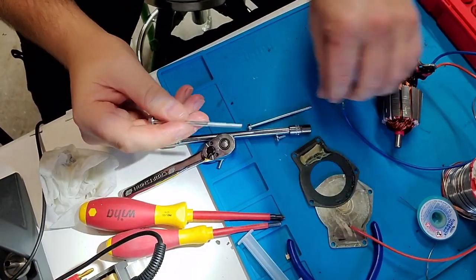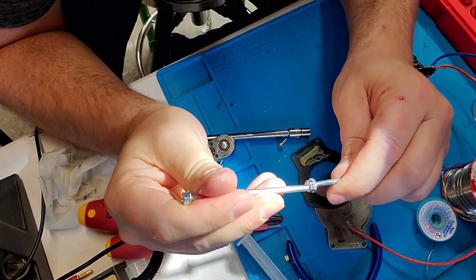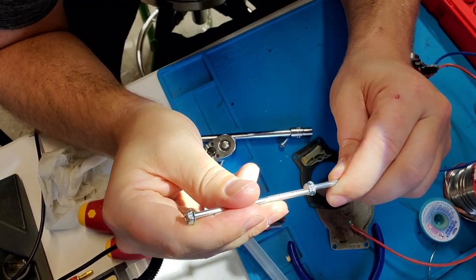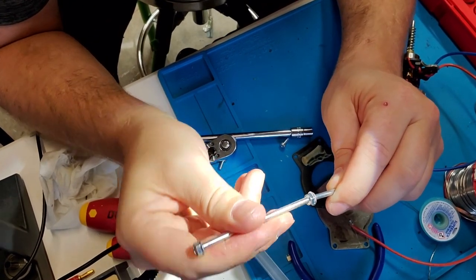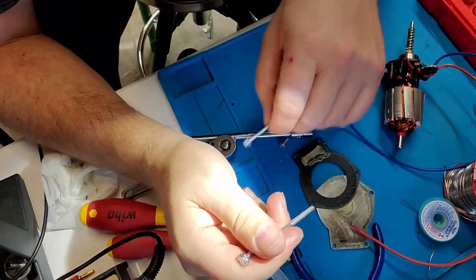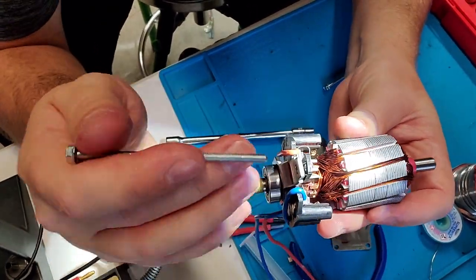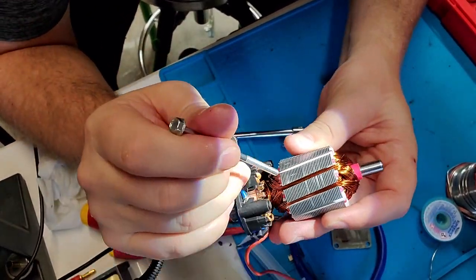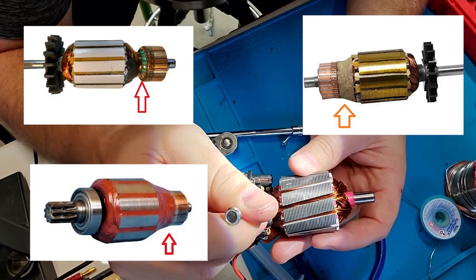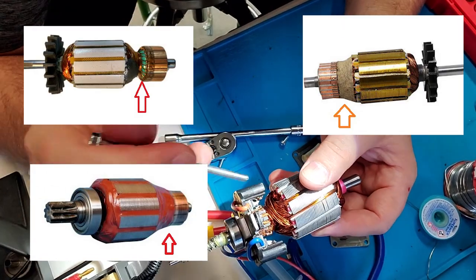When a wire vibrates over time, copper work hardens, which means it gets brittle. If you've ever taken a piece of copper and bent it back and forth and it just snaps off, that's what happens on these commutation bars. And it happens all the time, especially on older tools. So nowadays, the way they mitigate that is they place epoxy down here in between the wires and the commutation bars, and that keeps those things from breaking.